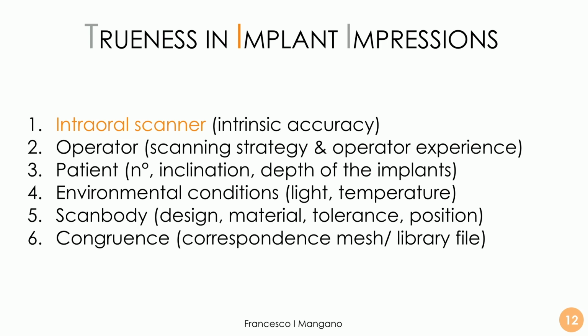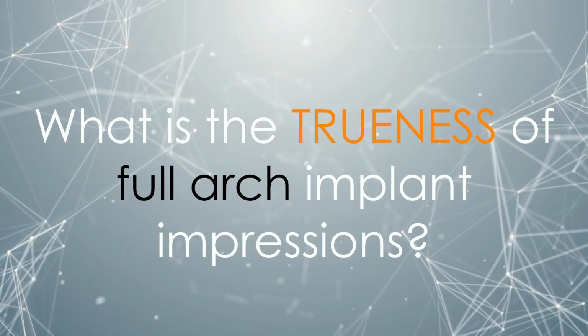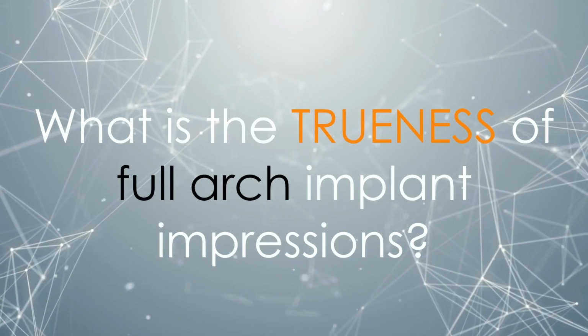implant impression. And then the congruence, that is a topic that we will treat and face in detail in one of the next lectures. So there are several factors, not only the intraoral scanner. Anyway, I think that the intraoral scanner is the number one factor we should consider.